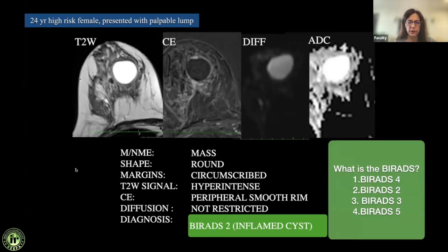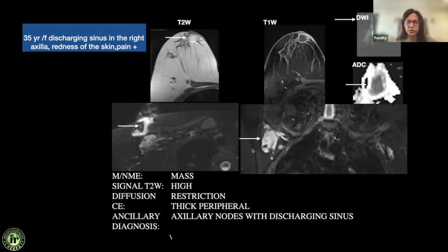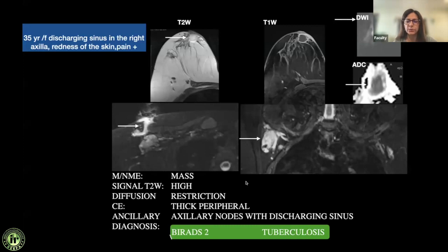Case 2: A 35-year-old female with a discharging sinus in the right axilla, skin redness, and pain — clinical history pointing towards benignity. Again a T2-bright lesion with peripheral enhancement, fairly circumscribed. On diffusion, the T2-bright component shows very dark ADC signal, indicating high-density contents consistent with an abscess — not solid, as there is only peripheral enhancement. Ancillary findings include a sinus tract and matted nodes. This is BI-RADS 2, confirmed as tuberculosis.